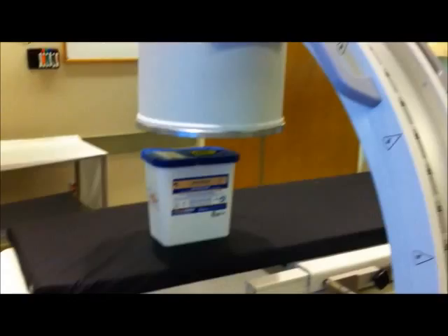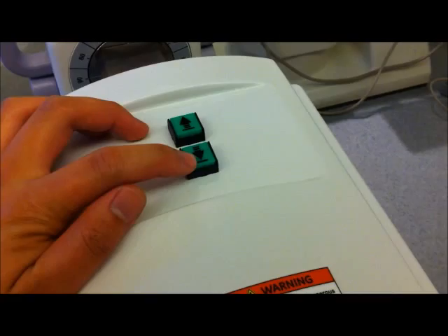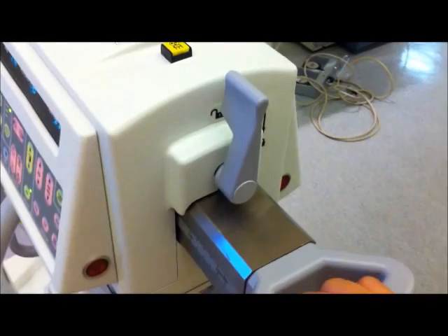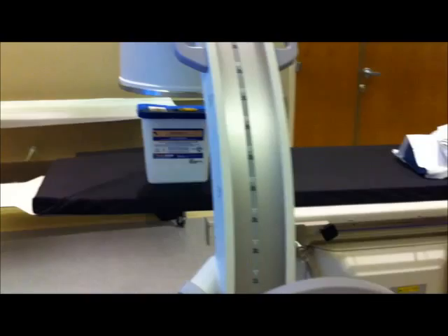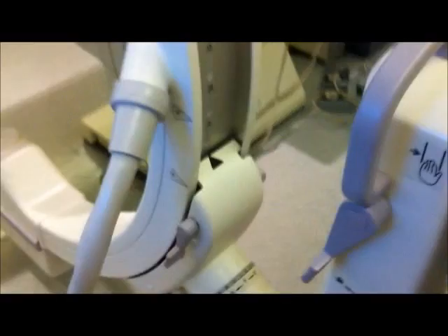Our patient's on the table and the C-Arm is positioned over the patient. These are our controls: this red button is the exposure button; these two green buttons are up and down — this raises the C-Arm height and this lowers it. This lock here, if you unlock it by flipping it up, you can pull the whole C in or out towards the patient. Let's pull it out to its fully retracted position and lock it down.